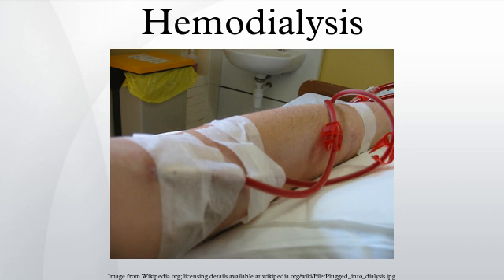Catheter access is usually used for rapid access for immediate dialysis, for tunneled access in patients who are deemed likely to recover from acute renal failure, and for patients with end-stage renal failure who are either waiting for alternative access to mature or who are unable to have alternative access. Catheter access is often popular with patients, because attachment to the dialysis machine doesn't require needles. However, the serious risks of catheter access noted above mean that such access should be contemplated only as a long-term solution in the most desperate access situation.